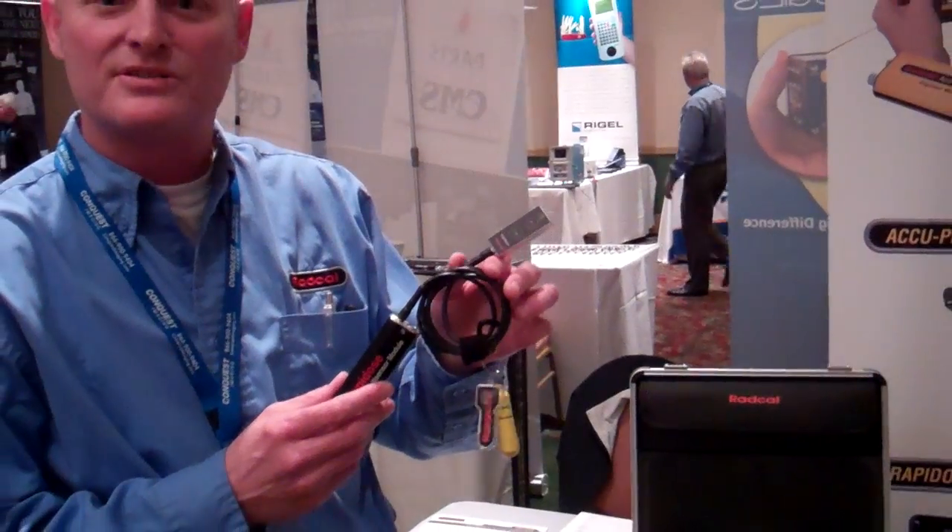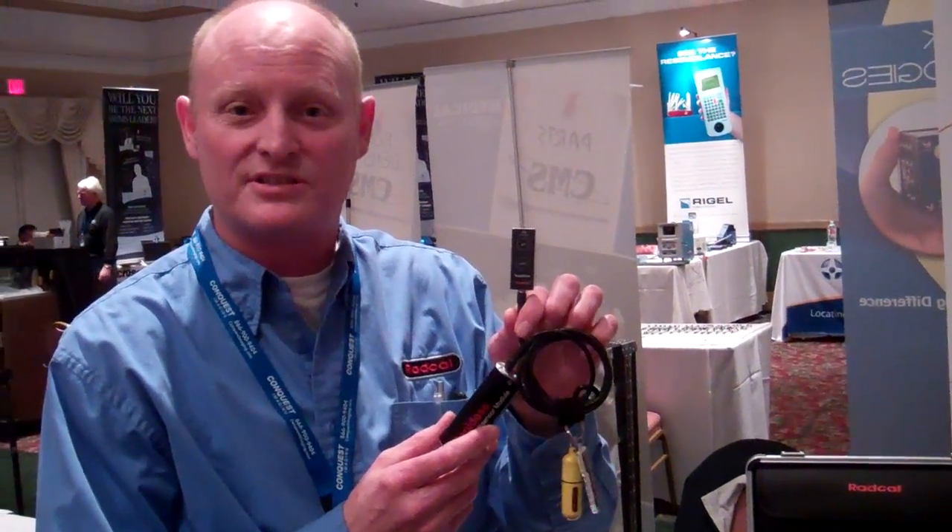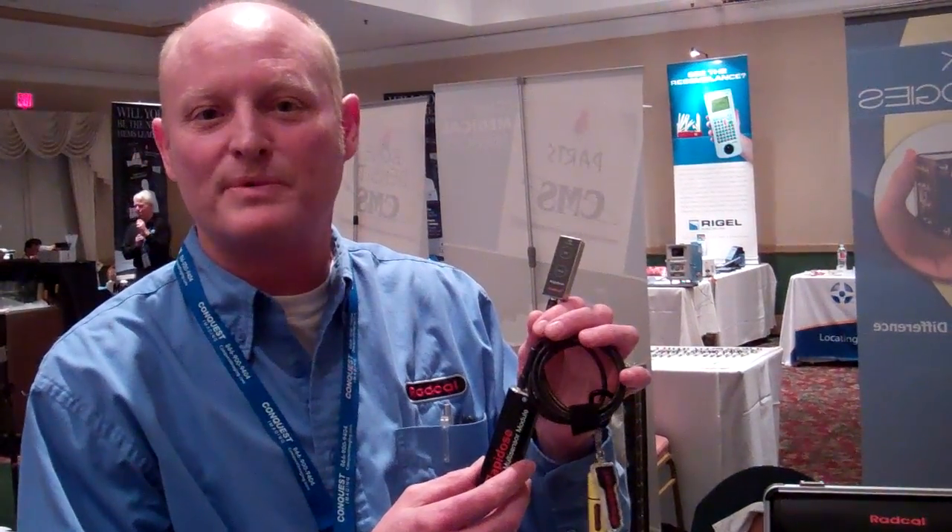I'm Steve Jack with RadCal. We've been in the imaging x-ray measuring kit system for 35 years, and our new system is our RapidDose, which is a solid-state multi-sensor for capturing dose, time, KVP, HVL, filtration. It even works as a scope and captures your dose rate and KVP waveforms.